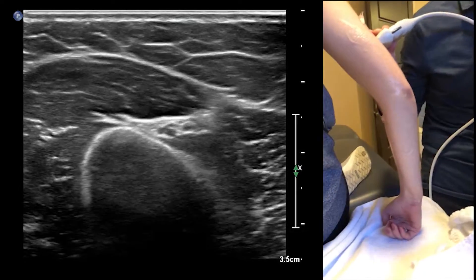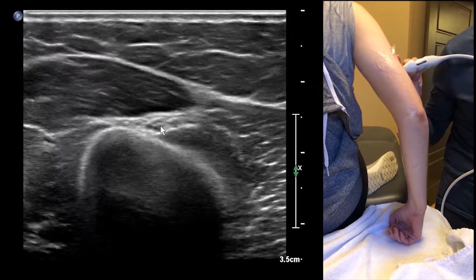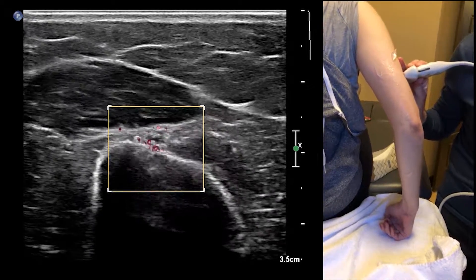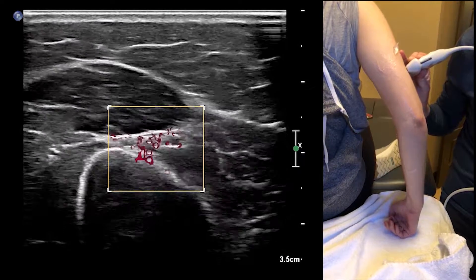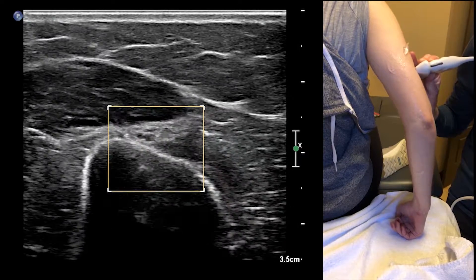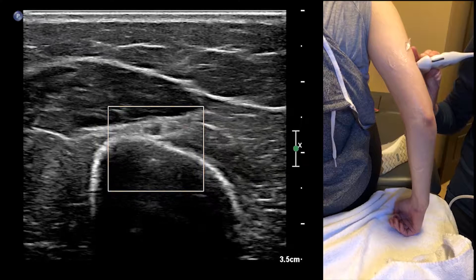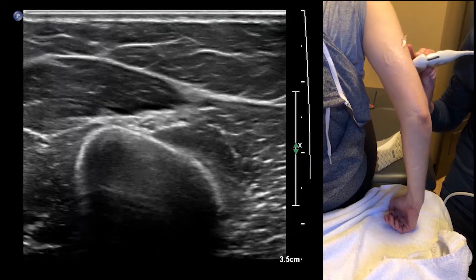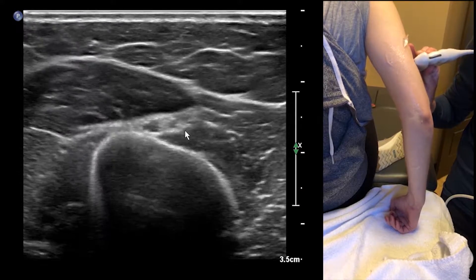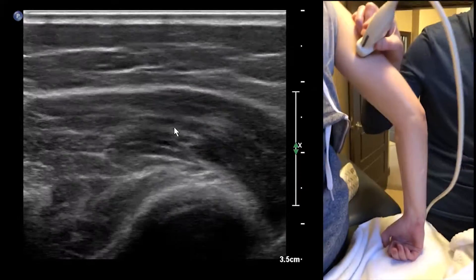A couple of landmarks to point out: the humerus, the radial nerve, and we've got some vessels here. Let me make our color box small. Not a lot of flow in this one, but we do have a couple of vessels surrounding it. This is the nerve here, the artery, and a vein — I'm compressing the vein there. The radial nerve here is going to be sending off branches to triceps as well.